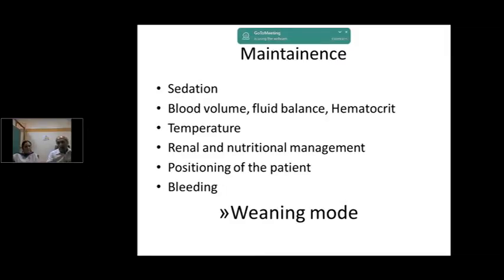During this we can see that sometimes we don't get adequate flow. That may be because of hypotension, where the blood volume may be less. In that case the lines chatter and the return is not much, so the BP is not well maintained even though the flow is. In that case, we have to treat the hypovolemia with blood or volume replacement.